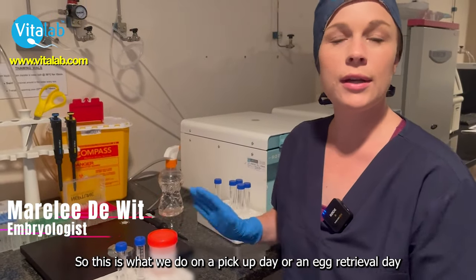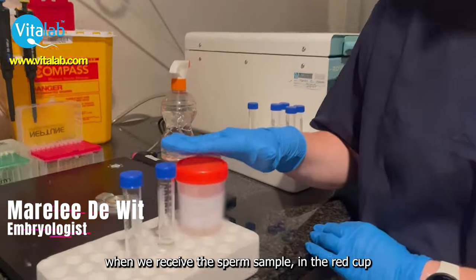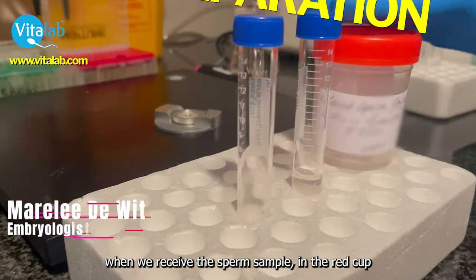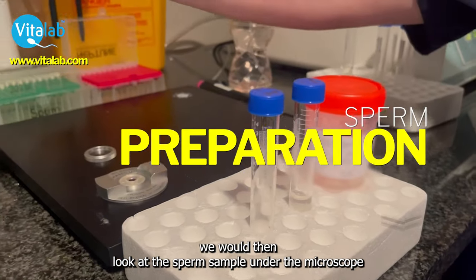So this is what we do on a pick-up day, on an egg retrieval day. When we receive your sperm sample in the red cup, we would then look at the sperm sample on the microscope.